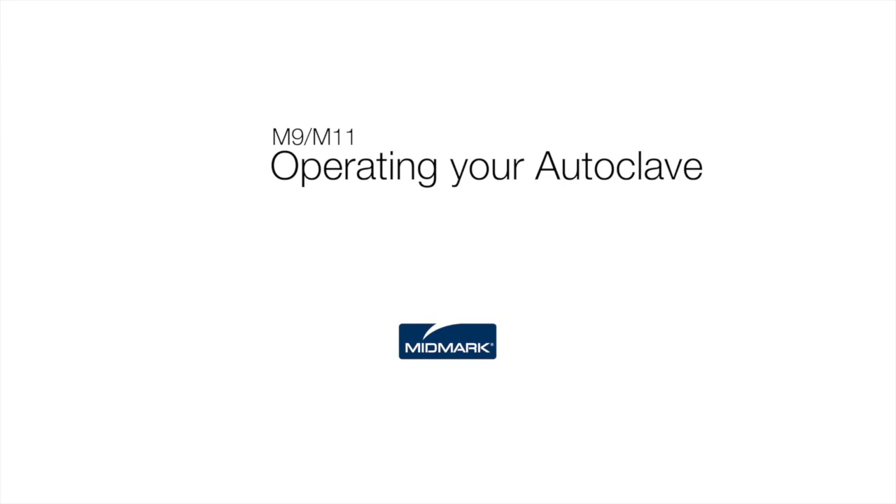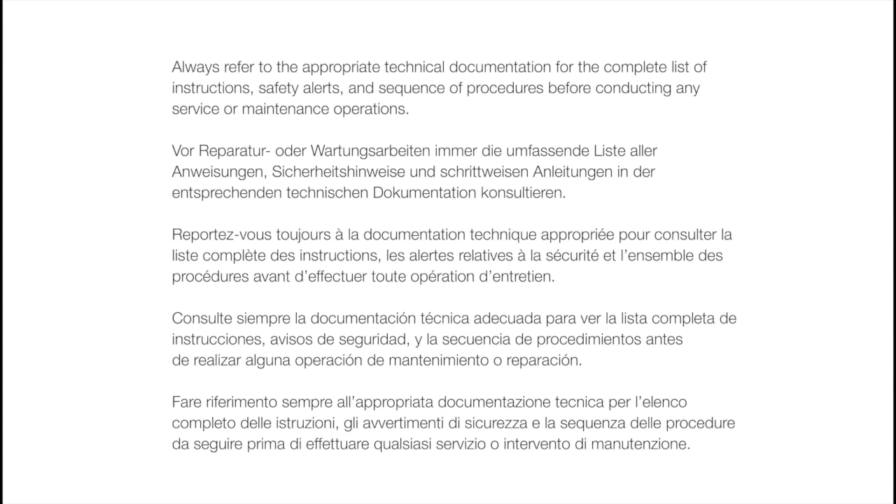This video is an overview of how to operate your Midmark autoclave. Always refer to the appropriate technical documentation for the complete list of instructions, safety alerts, and sequence of procedures before conducting any service or maintenance operations.